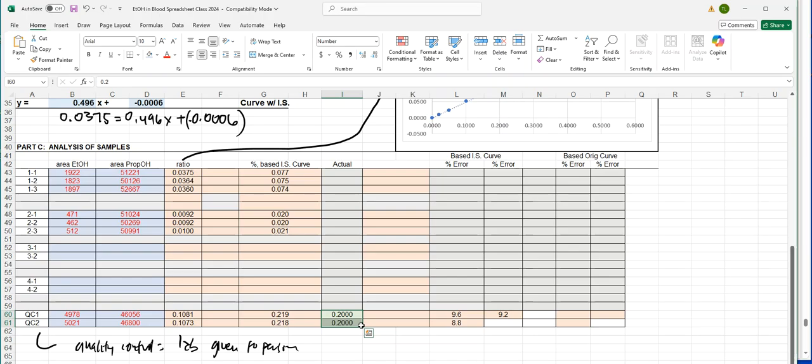That is probably a change and an update that has happened before I push the spreadsheet out to you for that particular year. All right, so with that said, we know a number, we've received a number, and we've got to know, okay, well, what is our error. So that's what these two values or these two columns are over here.